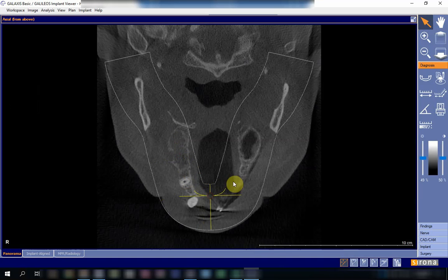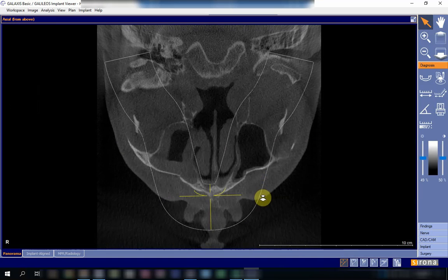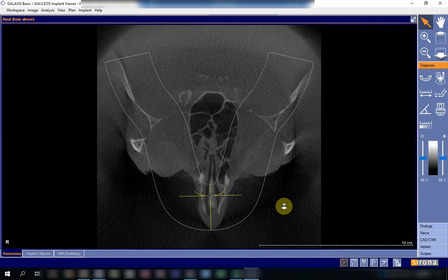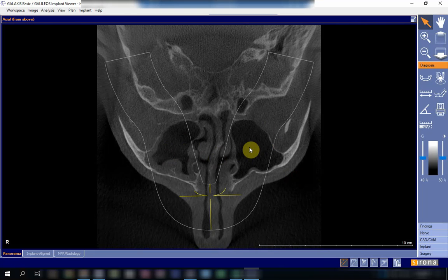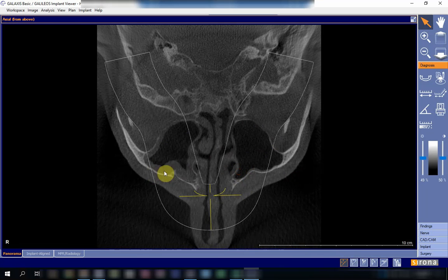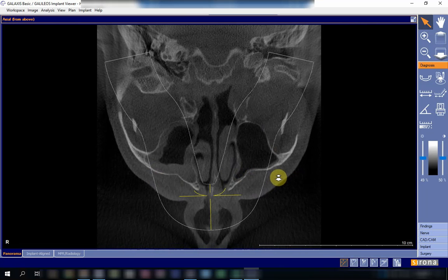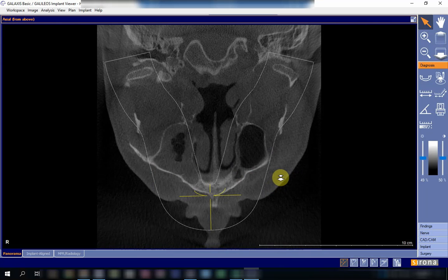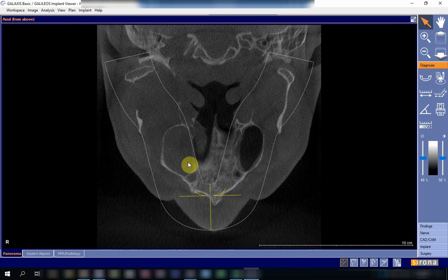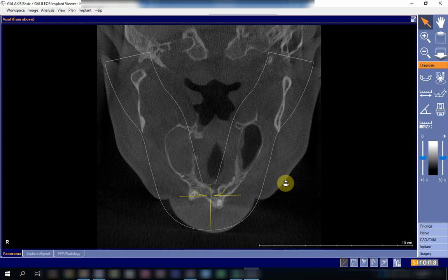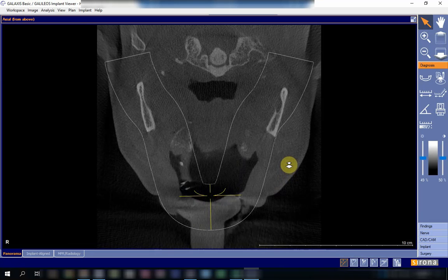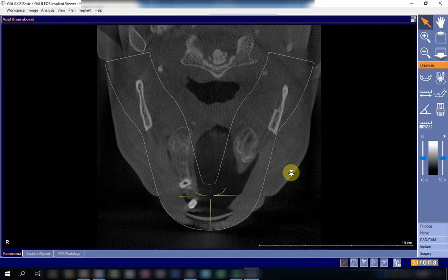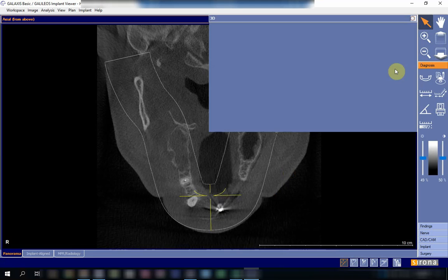Now let's look at the axial view, starting from the superior surface and going downward. At first, both sinuses appear normal, aside from a small possible mucosal polyp on the anterior wall. Going down further, comparing both sides, the mucosal lining on the affected side becomes almost completely obliterated in this region — all blocked — due to the oral antral communication.